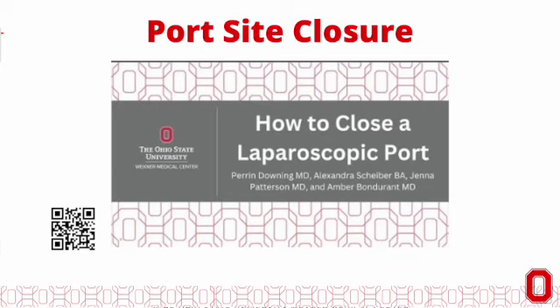After closing each laparoscopic port site, they must be adequately cleaned and covered. Typically, port sites are cleaned using laparotomy sponges and sterile water provided by the surgical technician. Once dry, the closed and cleaned port sites can be fortified using a topical adhesive such as skin glue or a bandage such as a Steri-Strip or Band-Aid.